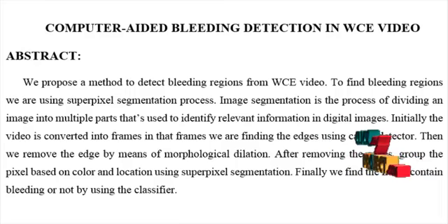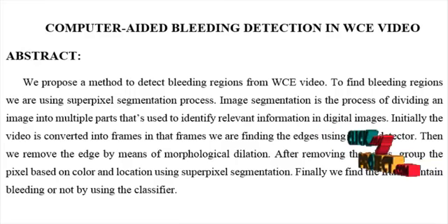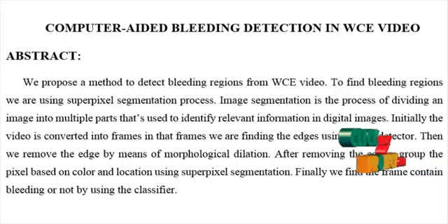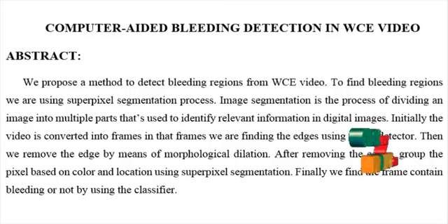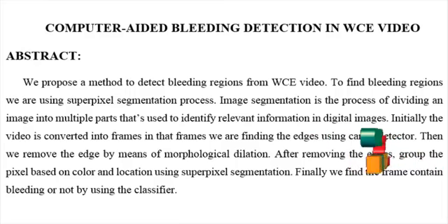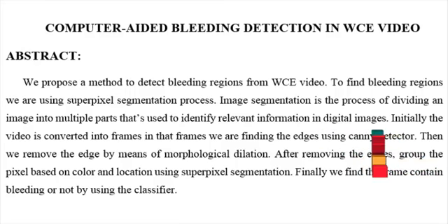The canny edge detection is an edge detection operator which uses a multi-stage algorithm to detect a wide range of edges in the images. Initially, Gaussian blur was applied to the images in order to eliminate the unwanted edge information in the images. Then gradient operators were employed to find the gradient intensity and the directions. Non-maximum suppression determines if the pixel is a better candidate for the edge than its neighbors.